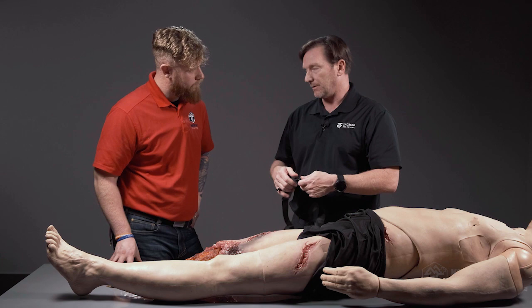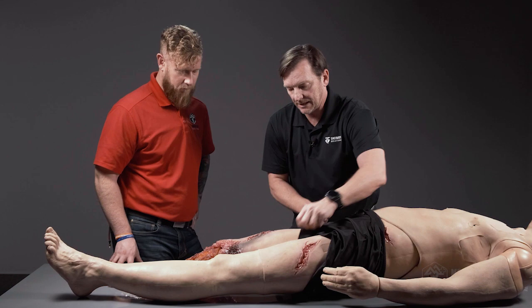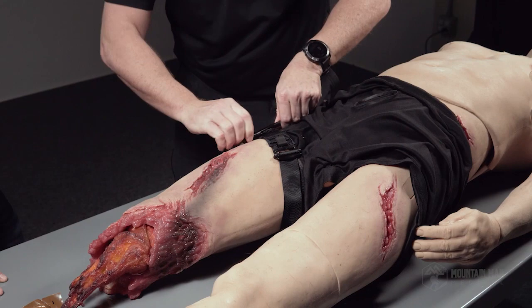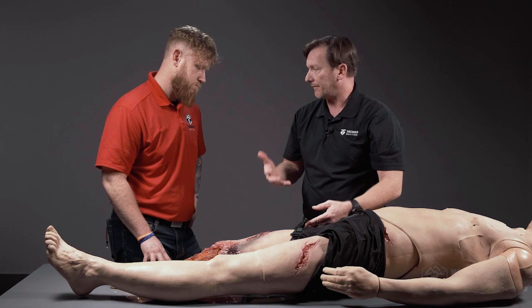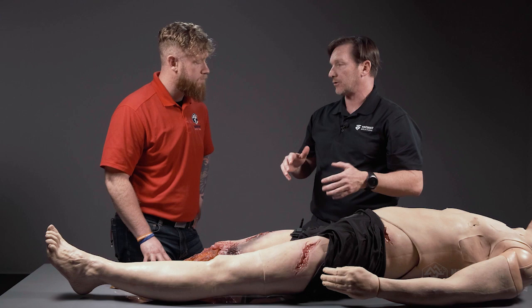One thing I always like to do — and we've talked about it in other videos — is always have the free running end to the inside of the body. That allows me to put the tourniquet on the same way every time. With our open loop design, you run the tourniquet under and pull the slack out so the slack wedge indicator disappears. Then turn until the bright red bleeding stops. Once it does, you can place it inside the track as a temporary hold if you need to readjust, but the definitive fix for securing the device is the tri-ring on the end.